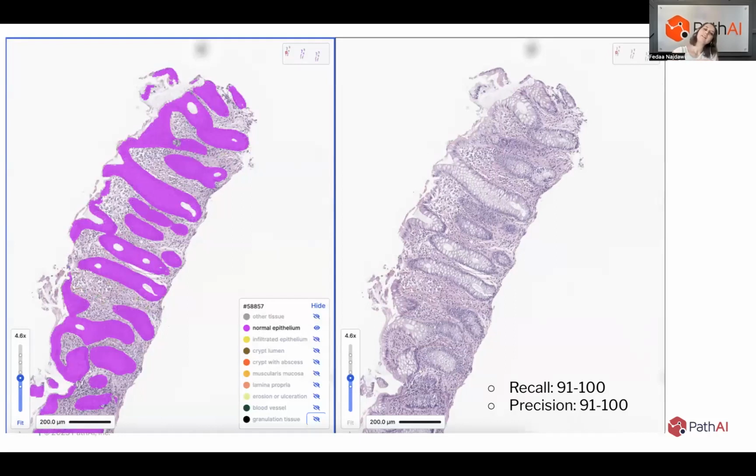Now, here is a comparison or a contrast between looking at everything together and just picking one tissue region or substance and assessing that separately. So here is how I would suggest assessing the tissue model, and that's specifically more applicable for the tissue model because there are many different substances at once. That's how I would suggest we approach the whole slide image.